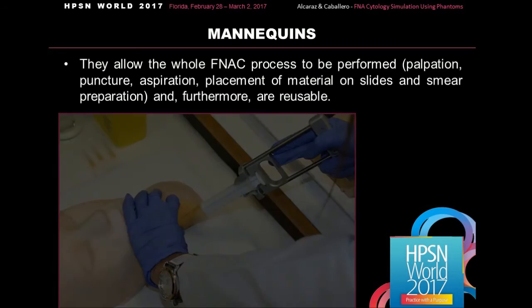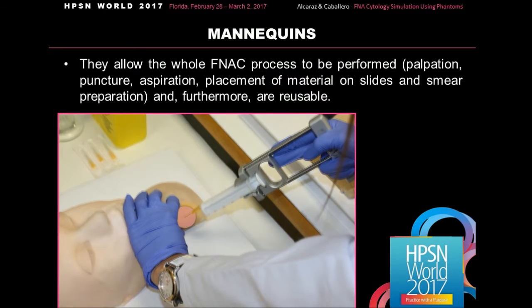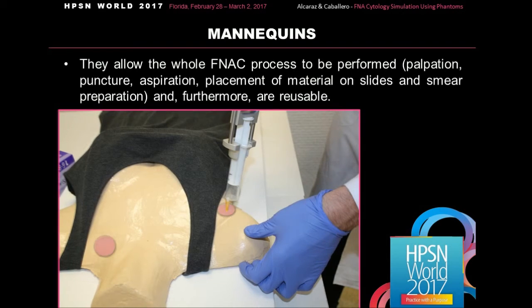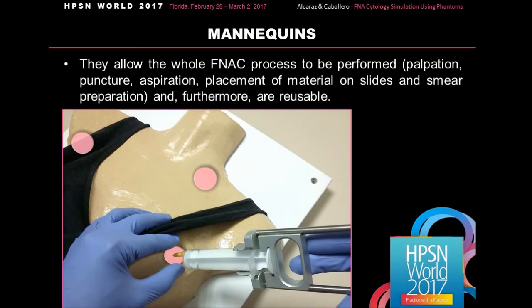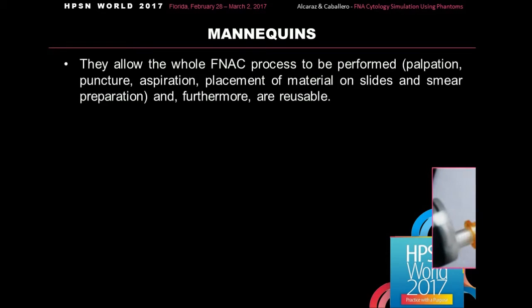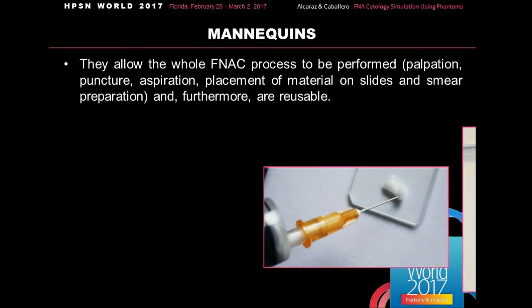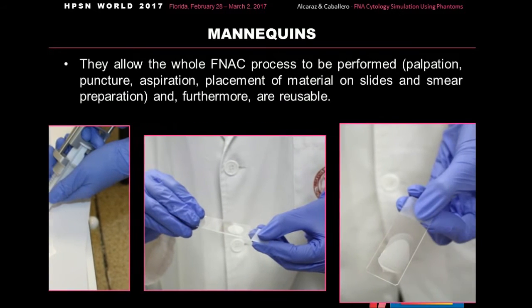They allow the whole FNA process to be performed, which consists of palpation of the area, puncture, and aspiration into these different locations like neck, axillary, supraclavicular, or breast, among others. Then, you can proceed with the placement of the material on glass slides and do the smear preparation, like this.